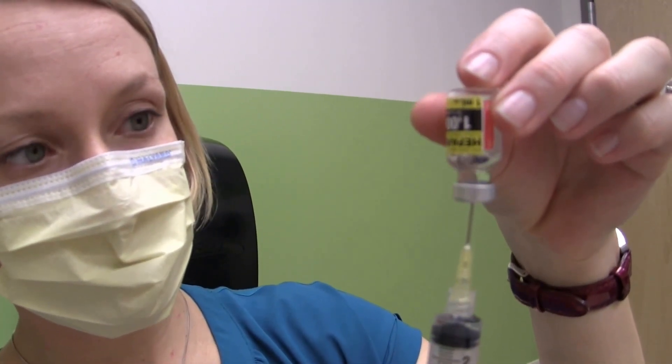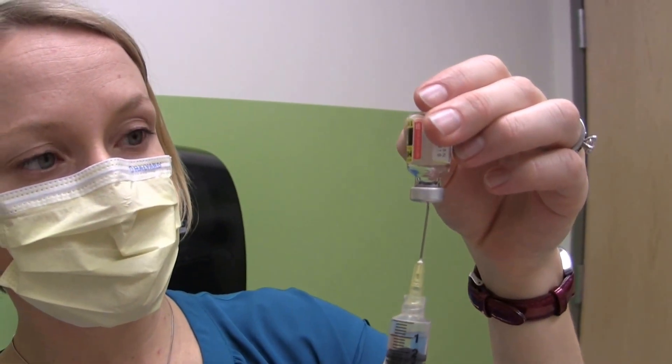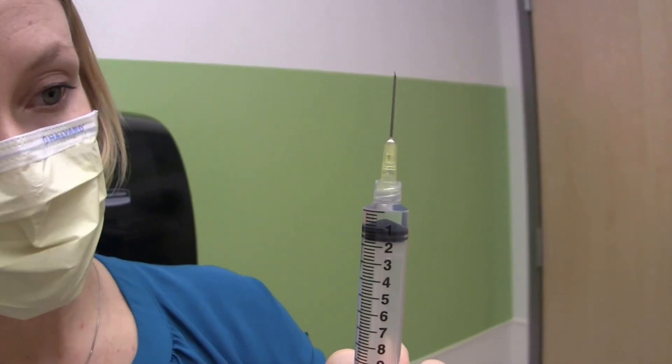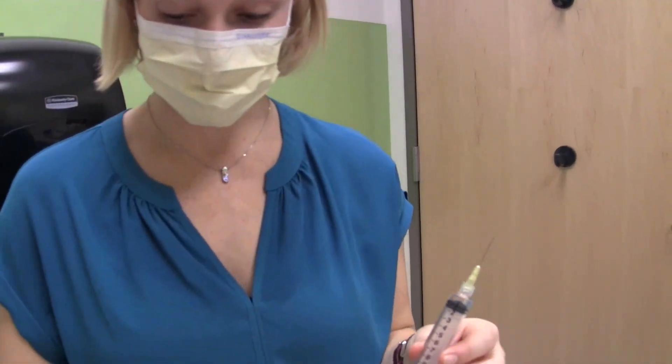The syringe will start to fill. I'm going to try and get as much out of that vial as I can. I know to put in one milliliter of heparin because that's what my nurse told me to do. So if you ever have questions, always make sure you call — it's also in your emergency kit.